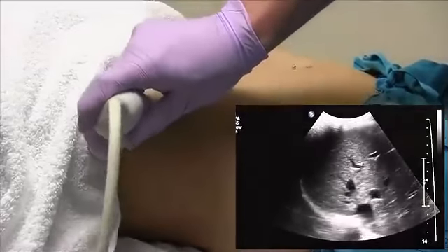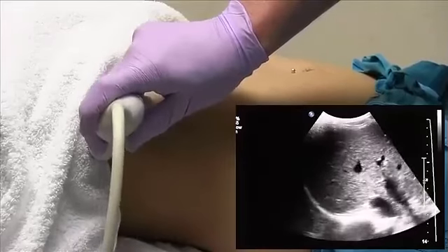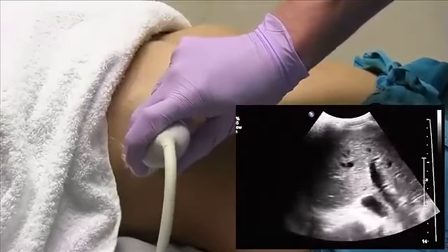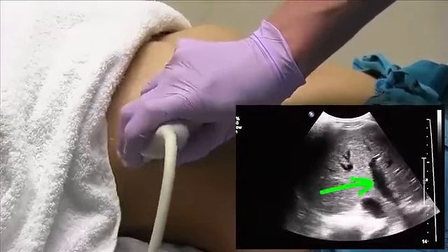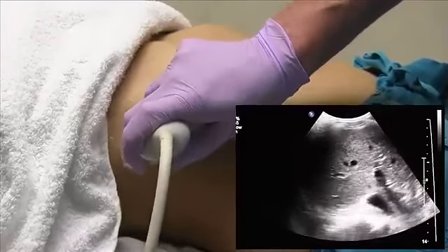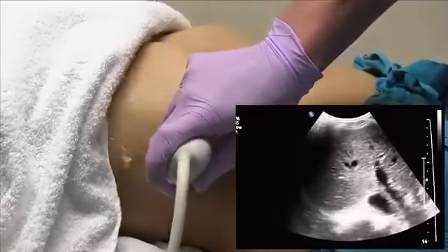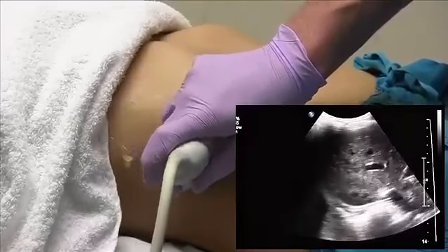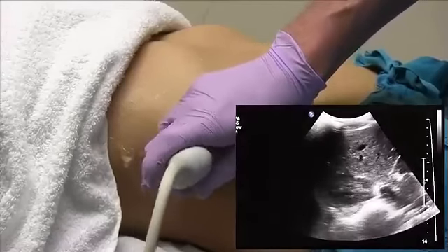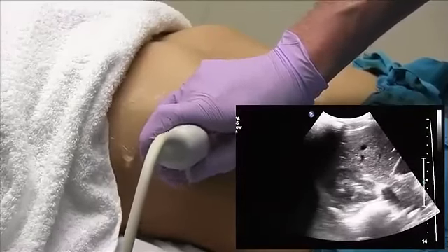As you're doing this, you're still getting those same pictures, one at the dome of the right lobe, one at the hepatic veins, and then as you jump down, you'll get a picture of the main portal vein, and you can also see the main portal from this window split into right anterior and right posterior portal vein. At the last rib space, you should start to see the upper pole of the kidney against the liver surface. From here, you can kind of judge the echogenicity of the liver and the kidney.